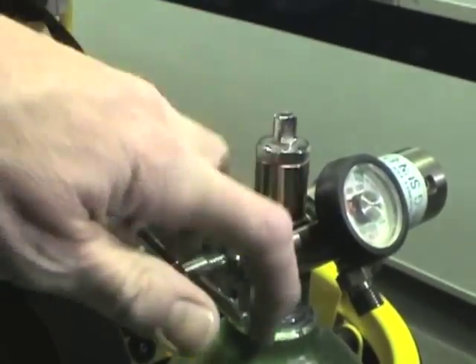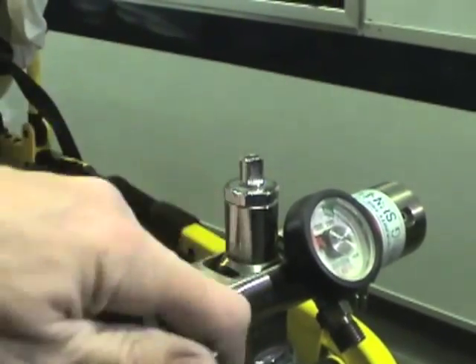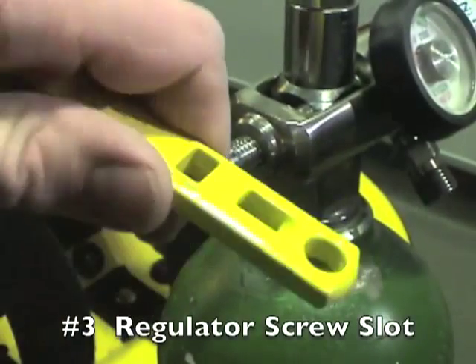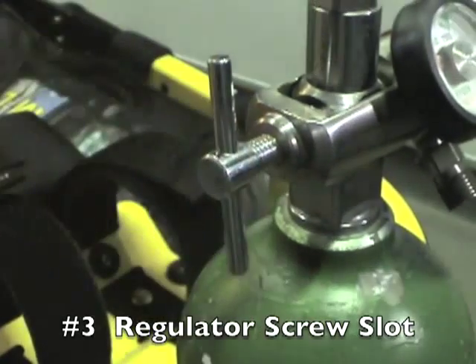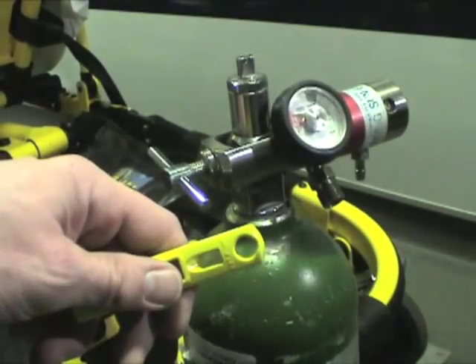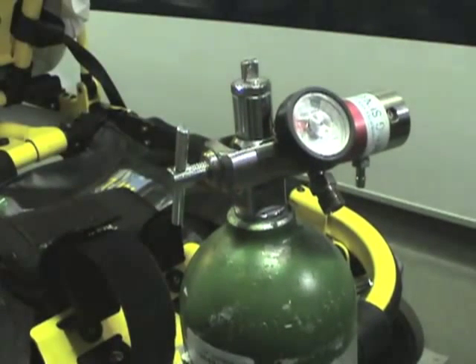What about that pesky thumb screw? That thing on the regulator that digs into your hand — it hurts, it's not comfortable to tighten or loosen, and it's hard to get it attached right. Well, there's a regulator screw slot, and that's reason number three to have this tool. It fits on the regulator screw, makes it easy and comfortable for your hand to loosen it or tighten it back up again, and if you've really got it tight, it can be used at a couple of different angles for additional leverage.